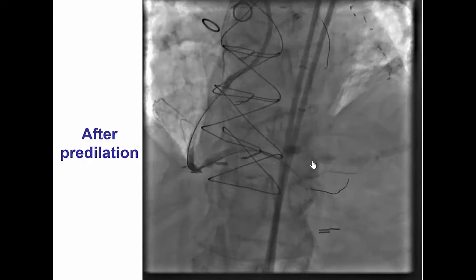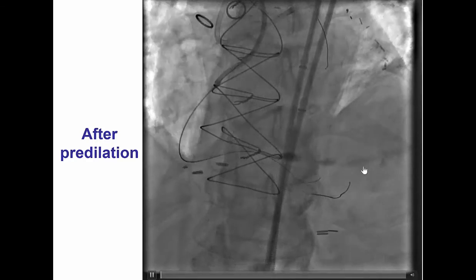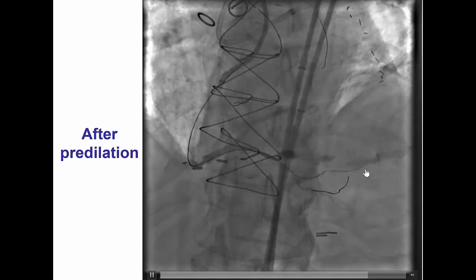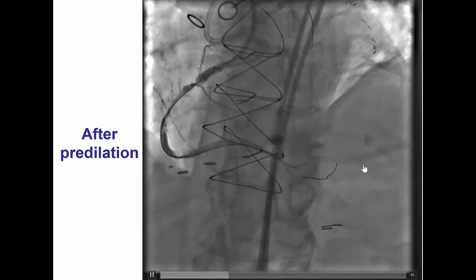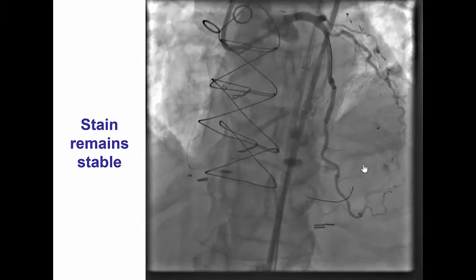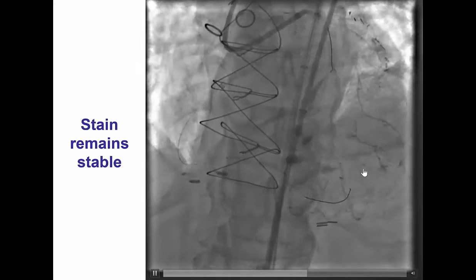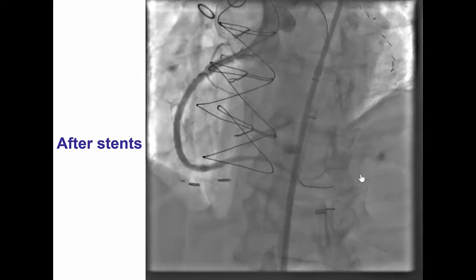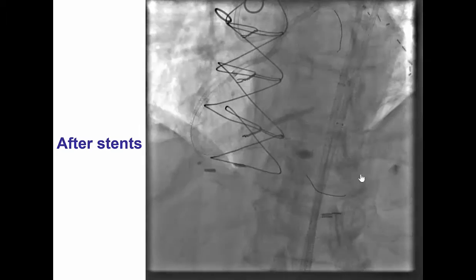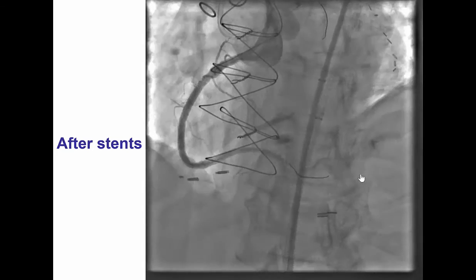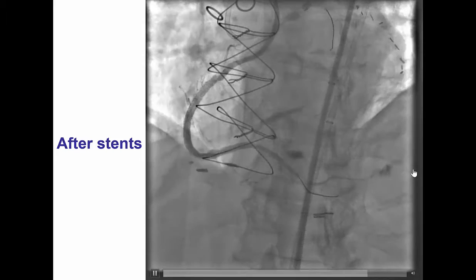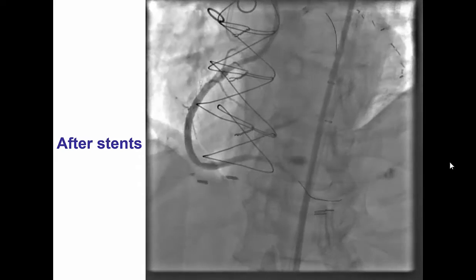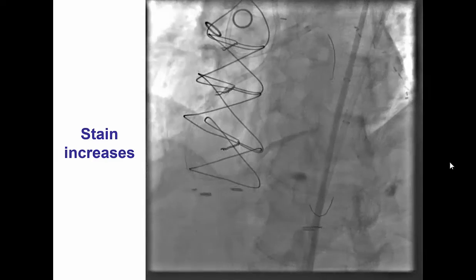After the lesion was pre-dilated, there was an area of contrast extravasation into the branch that the wire had originally gone into. The stain appeared stable, so we elected initially to let it go, especially since there is a concept that perforation in previous bypass patients is less likely to cause tamponade because adhesions prevent the formation of free pericardial effusion.